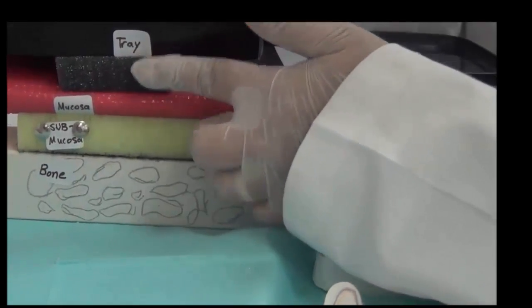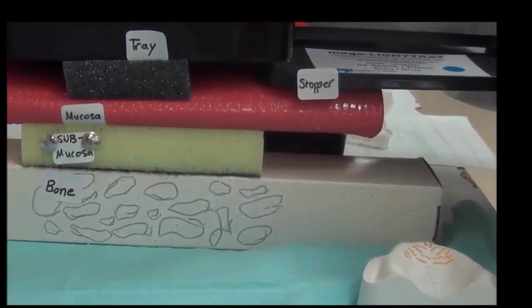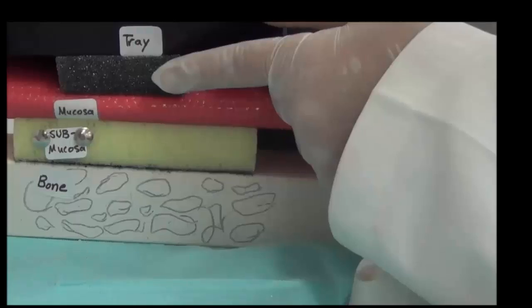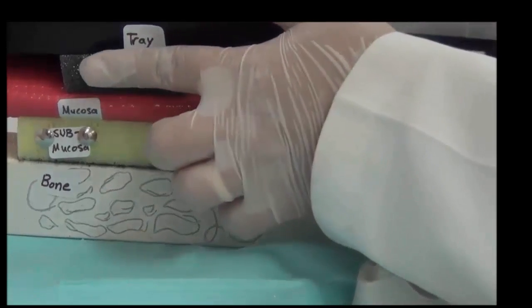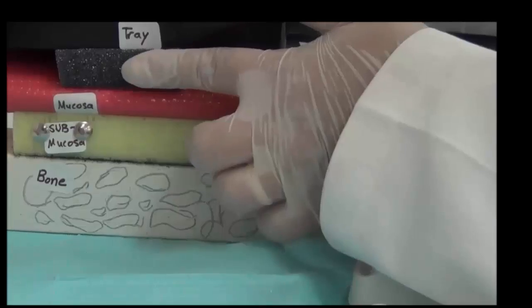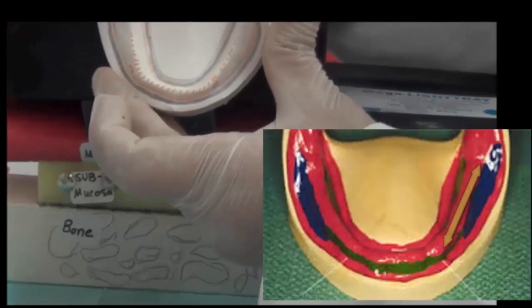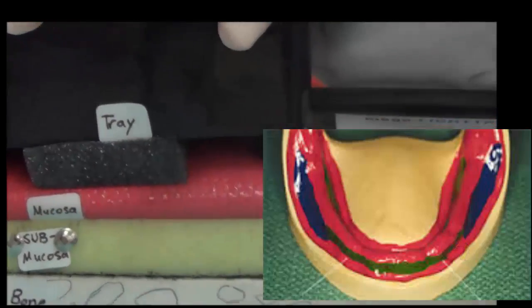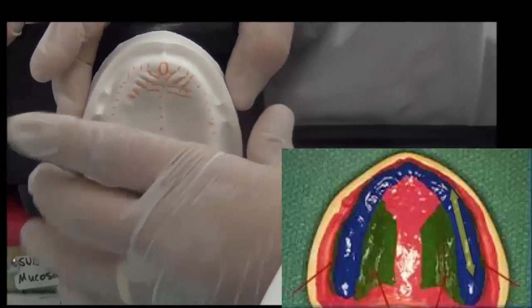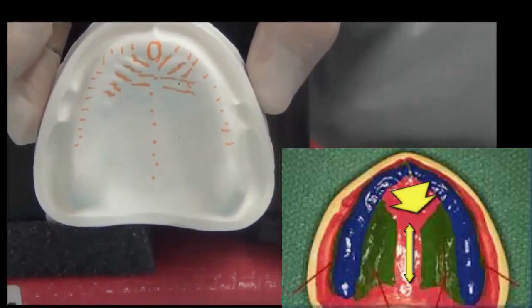This is called a mucostatic technique. Notice that the mucosa and submucosa are not in a compressed status as they were in the tissue compressive technique. So this relief that we made with wax maintained a space for the impression material to be equal in space, and not exert any pressure on the mucosa while I'm pressing on the rest of the impression. The areas that follow this are, in the lower, the relief areas: crest of the ridge and the mental foramen area. While in the upper they are the crest of the ridge, the incisive papilla area, the rugae area, and the mid-palatine raphe area.